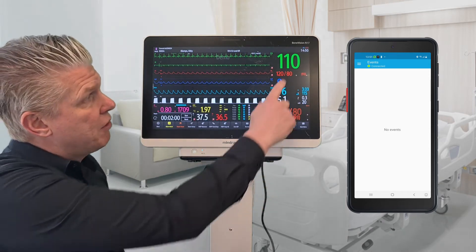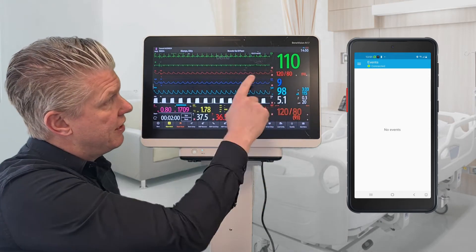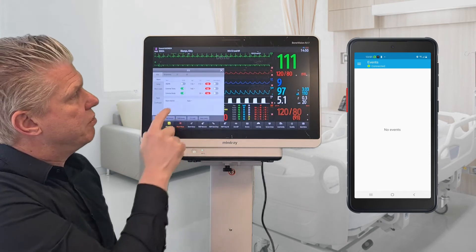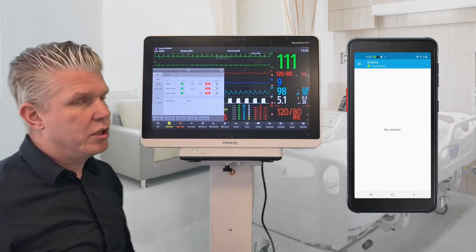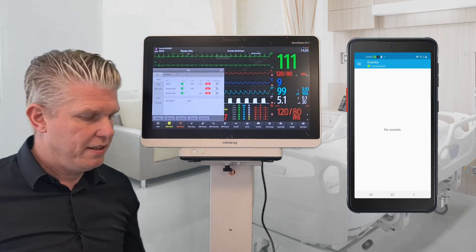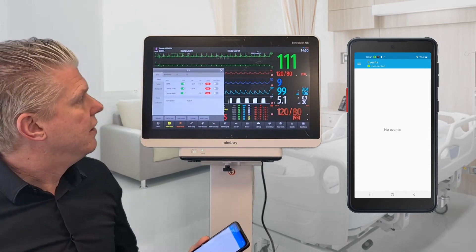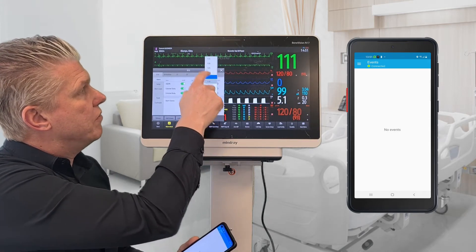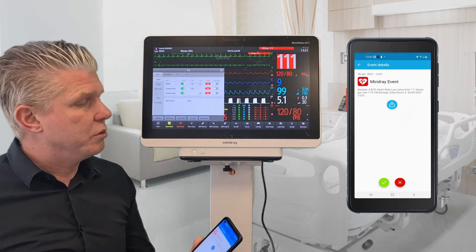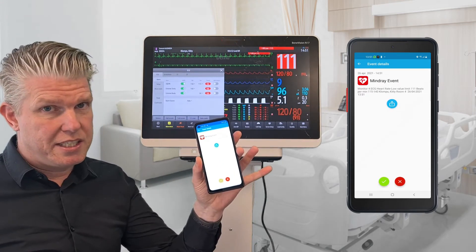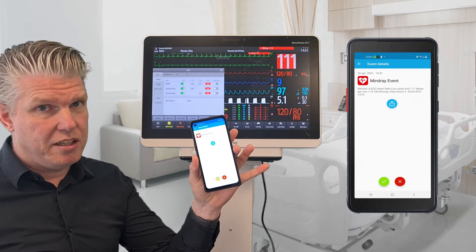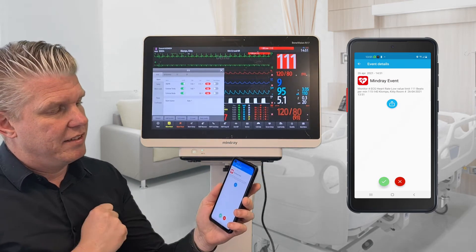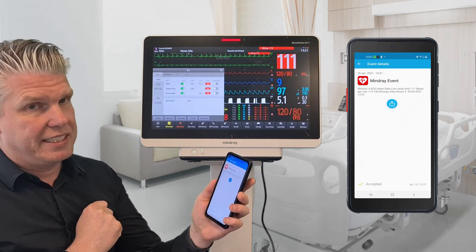I'm going to create a red alert. You see that the priority is red. I'm going to enable it and create the alarm. In this case you will see that the alarm is received.